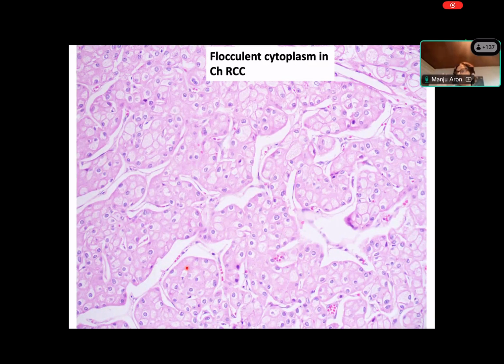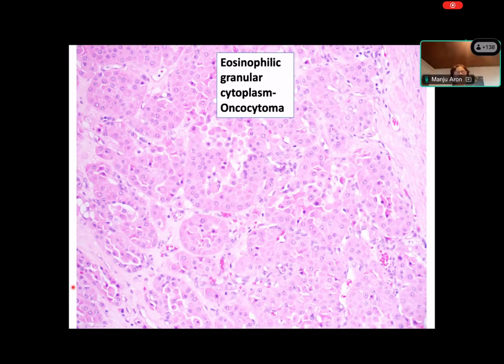So it's very important. Once you look at a pink cell, for example, you want to do a little more of a deep dive into the morphology of these cells, or look at the cytologic characteristics a little more closely. You'll see that in chromophobe RCC the pink cells have that flocculent cytoplasm, not very big granules, not densely granular. Whereas in oncocytoma, the pink cytoplasm is characterized by granules you can individually identify. So there's very nice eosinophilic granular cytoplasm. It doesn't have that clearing that is associated with chromophobe renal cell carcinoma.